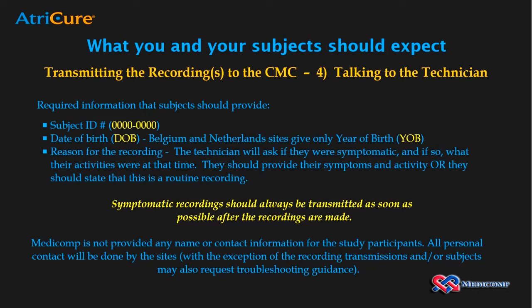A side note about the patient information: Medicomp has not provided any name or other contact information for the subjects. All contact is done by the site study coordinators. So we will not be able to call these subjects back if they hang up prematurely or the call is interrupted for some reason. Please make sure your patients understand this and remain on the line until the technician releases their call.